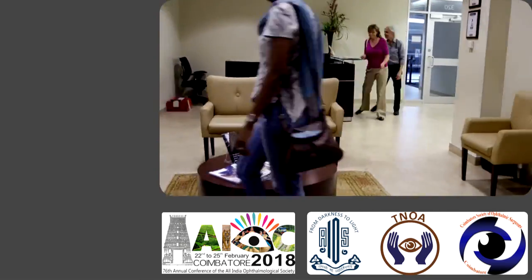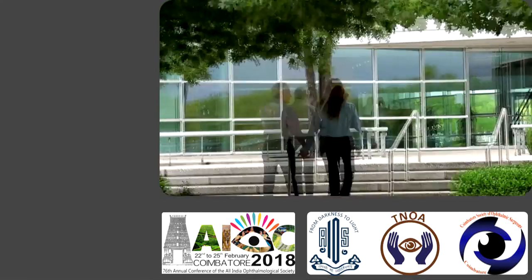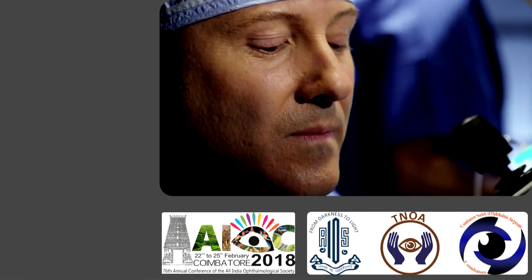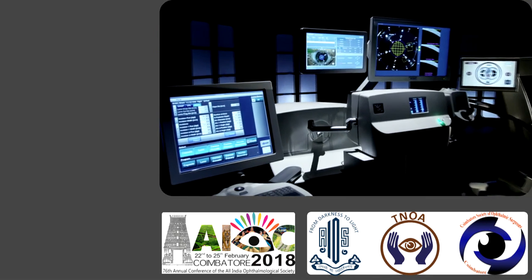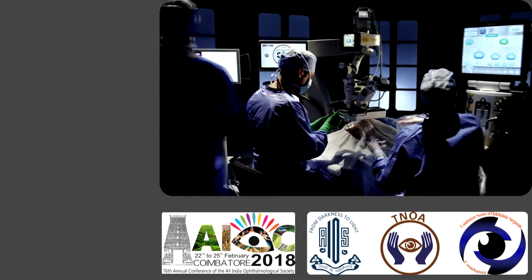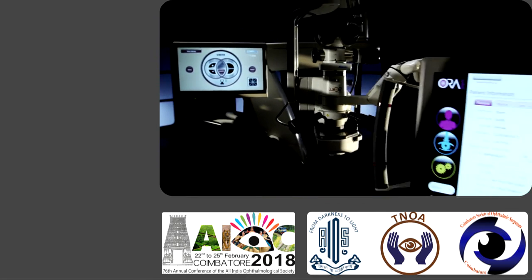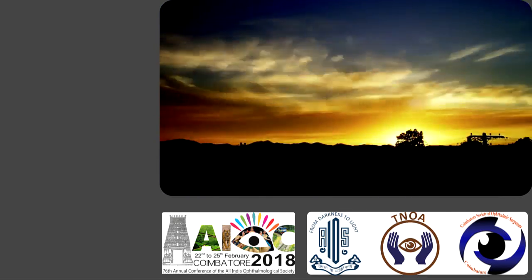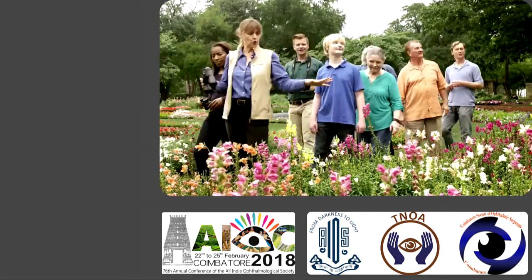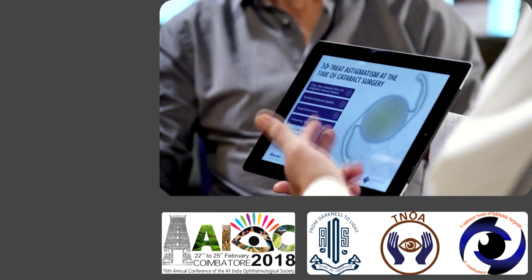Was it the moment the procedure was finished and sight was restored? Or was it before that, when the patient first looked into your caring eyes and knew that your skilled hands, along with amazing technology, would come together to make a successful outcome a reality? Each tool and device around you, precisely designed and selected to provide you increased precision and confidence during every step of the procedure. But even before that moment came, there was the realization that something needed to be done. The moment you knew you were equipped to help restore vision and exceed your patient's expectations.